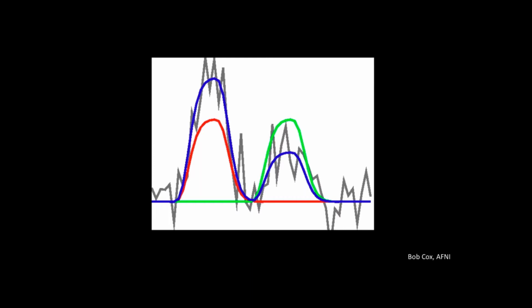I guess it is good to mention that this is what I found actually interesting. The regression terminology is basically the predictor. Yes. So it just regresses another terminologies used in fMRIs. Yeah, we're using the exact same terms. If you understand multiple regression in a behavioral context, it's pretty easy to translate it into an fMRI context.